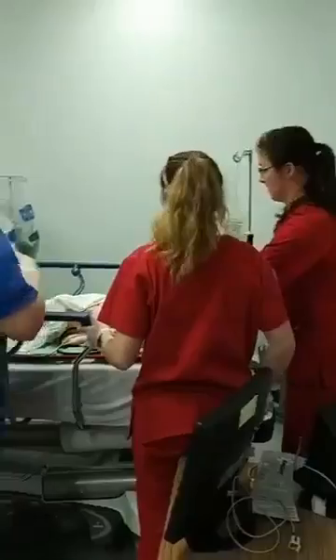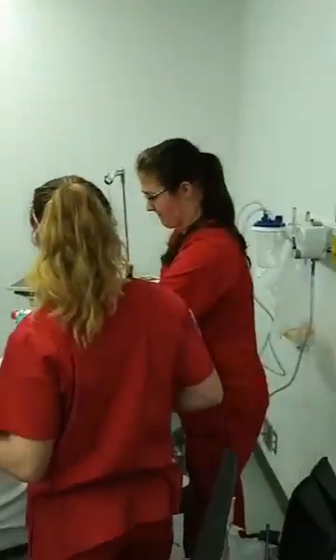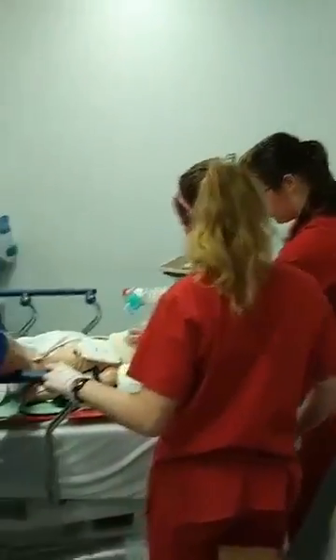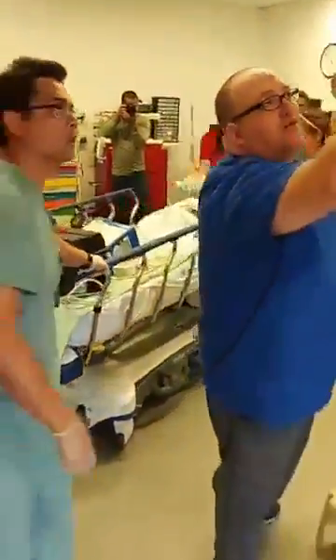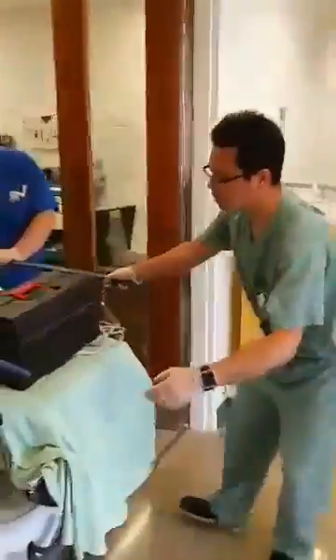So you're at the head of the bed, you're in charge, you let us know how fast we need to go, and if we're going too fast, okay? So you got the tube, it's secure, ready to go? We've got a good pulse. Okay, let's go, team. We're going to OR 2, so we have to go into the east wing. Yep. Oh, we gotta go through that construction, don't we? All right, good. Yeah. We're good.